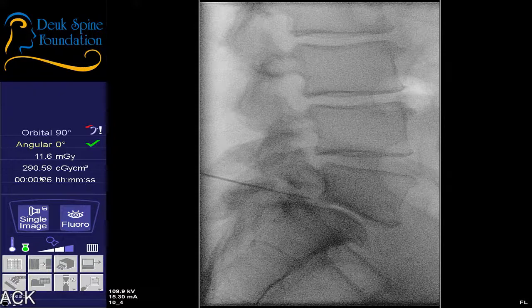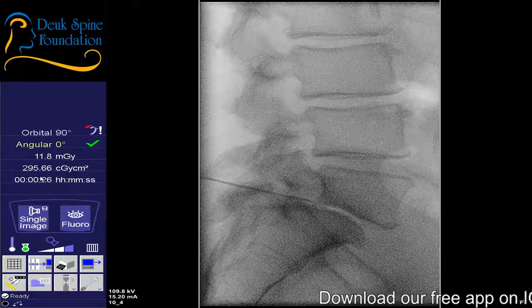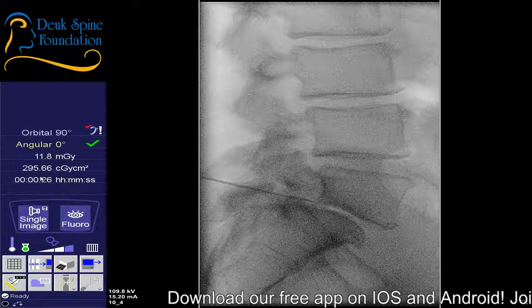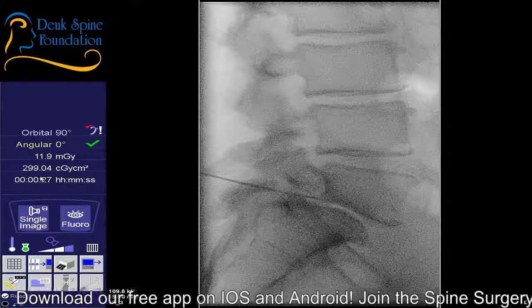We're right at the back of your vertebrae. Any pain? Yeah. I understand, but nothing new. Right there. Ooh, so close.